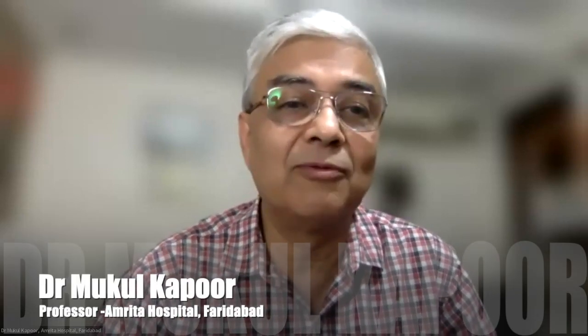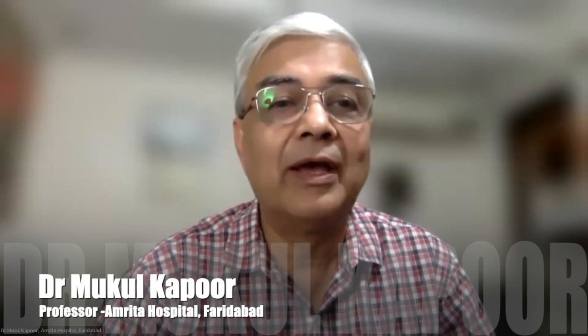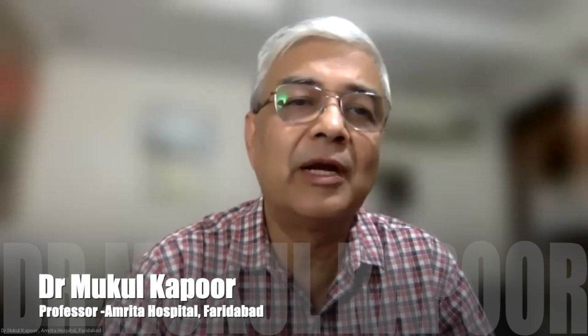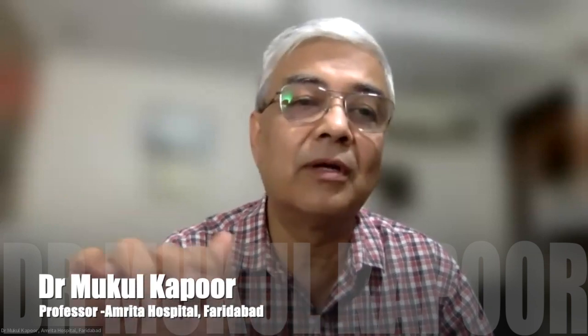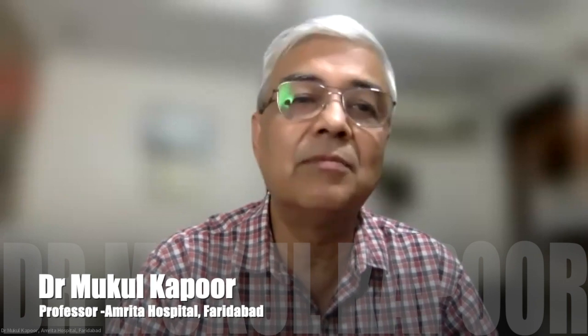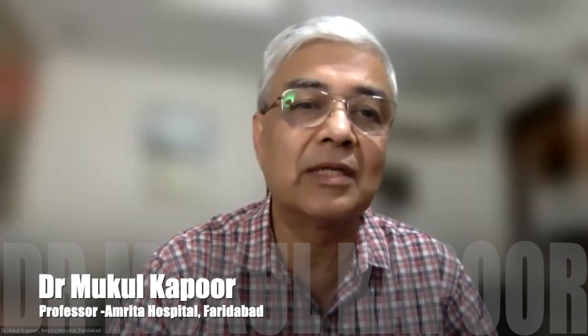Thank you, Dr. Gurudat. It's a very important question, and I'm very passionate about this, actually, if you ask me. Recruitment maneuvers is something which we have been ignoring for years. And we used to do sustained recruitment maneuvers, sustained inspiratory maneuvers earlier. But with the modern machines, you've got multi-step recruitment maneuvers. And that is the best thing about the machines. And this is there, of course, in certain GE machines, the advanced workstations. Also there in the Draeger Perseus, etc.